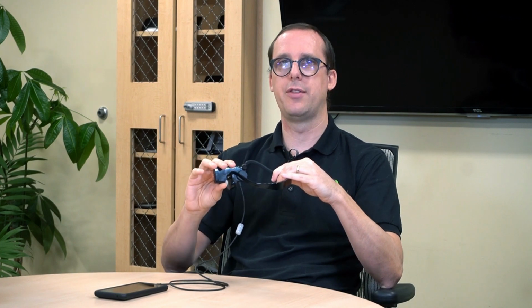Yeah, I like bone conduction. My two issues, one, I have a big head. And so I always have a hard time getting these to sit properly and feel comfortable. Second, I love the ability to have my ears free so I can hear my environment. But being bone conduction, you do lose some volume. So sometimes it's a little harder to hear what's going on from the headset itself. The reason that it's like that is because they wanted to keep your ears open so you can wear these while you're walking around. But as Corey said, that does affect your ability to actually hear what the device is saying. That's one thing to be aware of there.